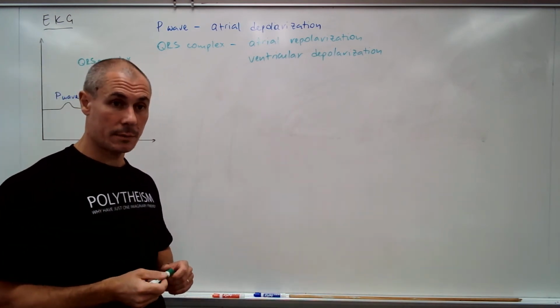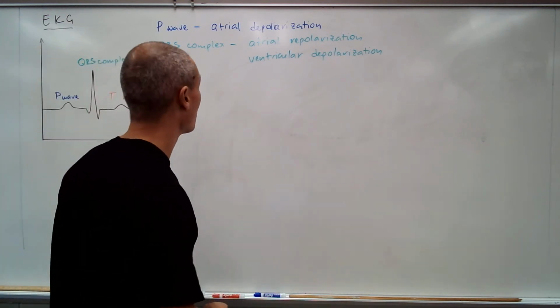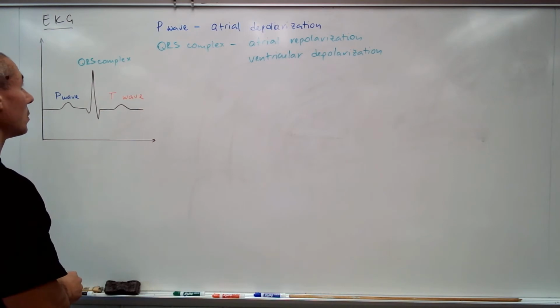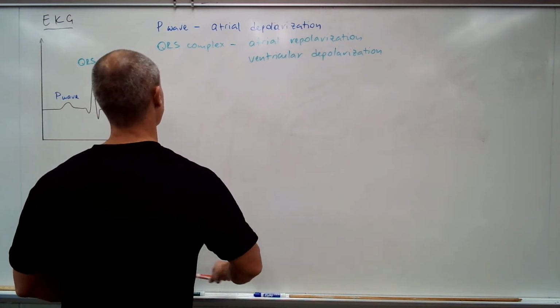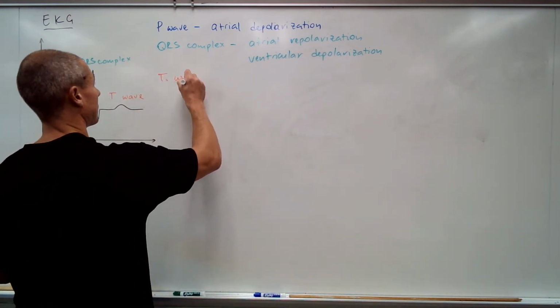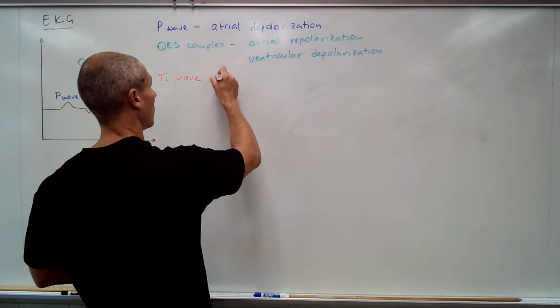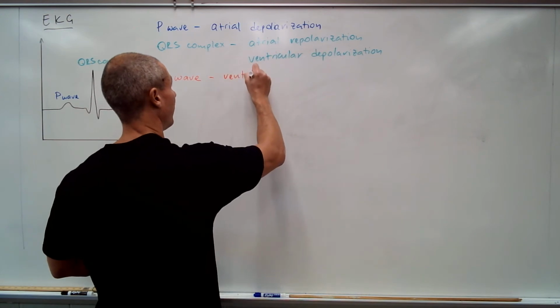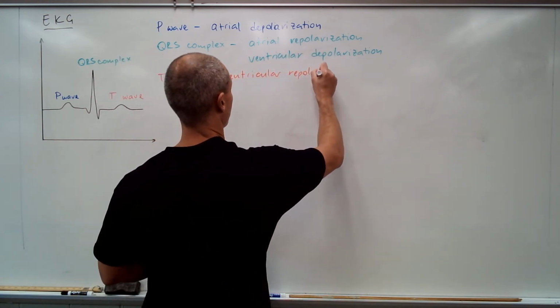Does that make sense? And then the T wave. The start of ventricular repolarization.